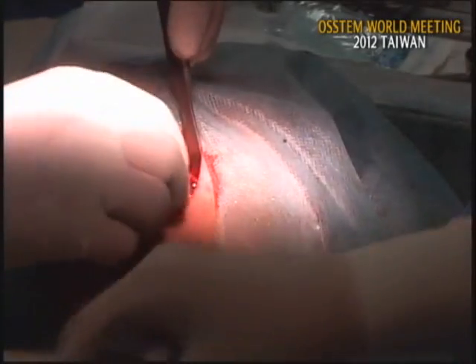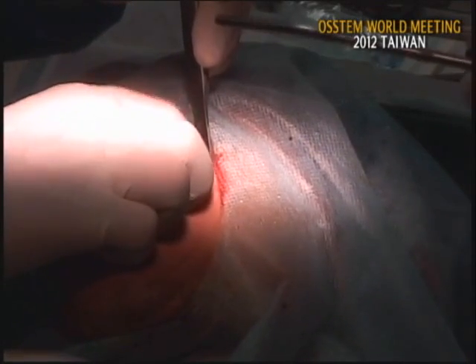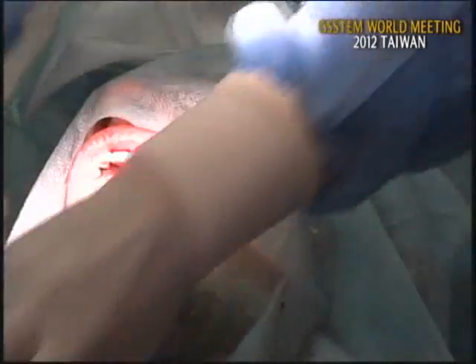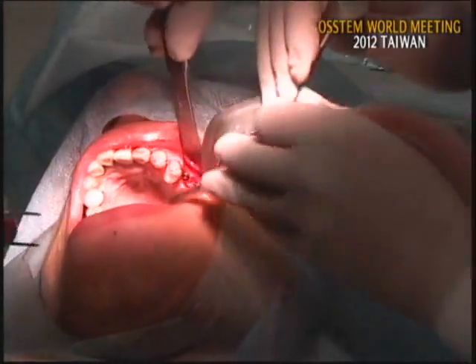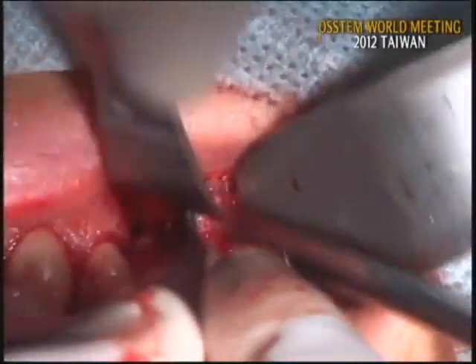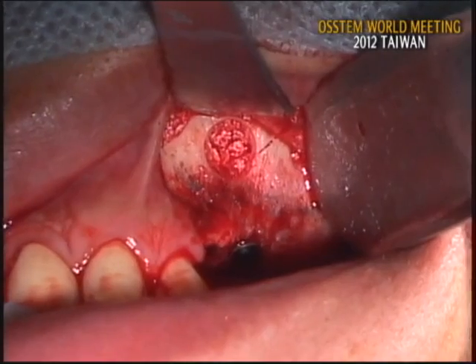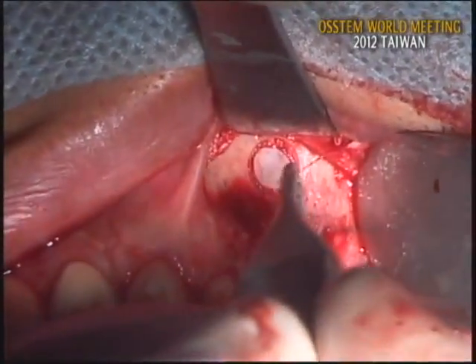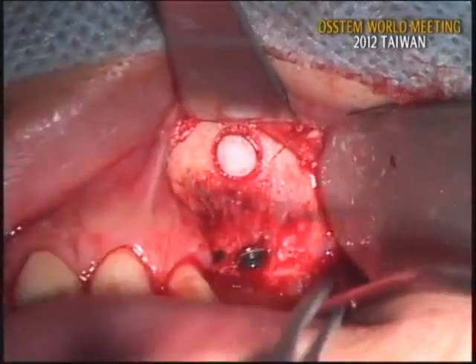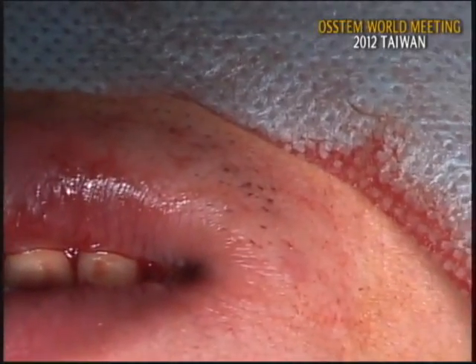Okay, one more. I reposition the bone window. Close, please. Okay. Here I can reposition the bone window. Instead of membrane, we can use the bone window like this. Okay. Let's close the flap. Open, please. Right turn.